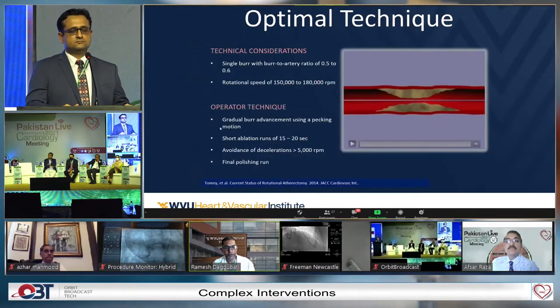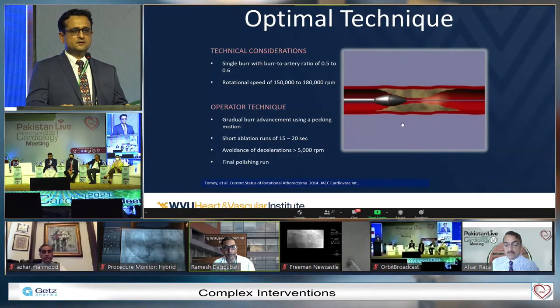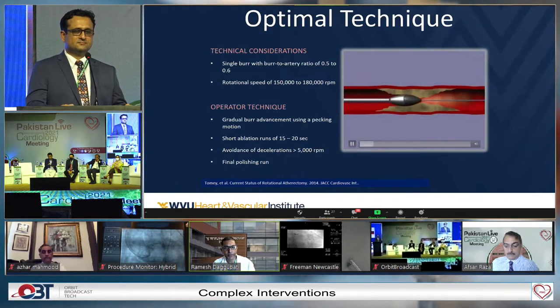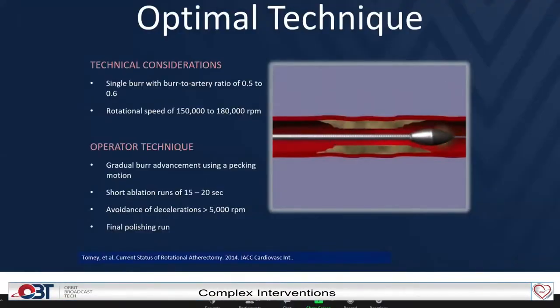So here is a nice demo of how it should be done. Go peck, come back, and again one more time peck, and then you might cross through it. This is very nicely done, and then you see that it is a polishing run.